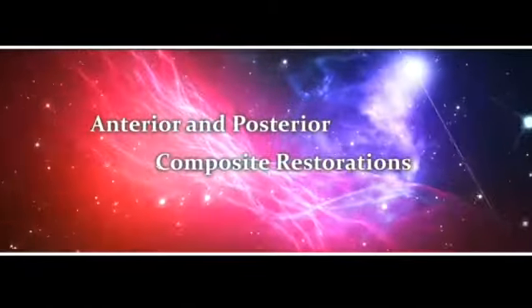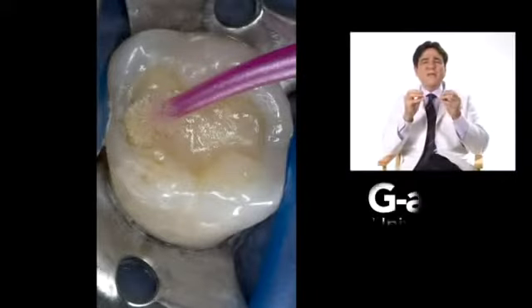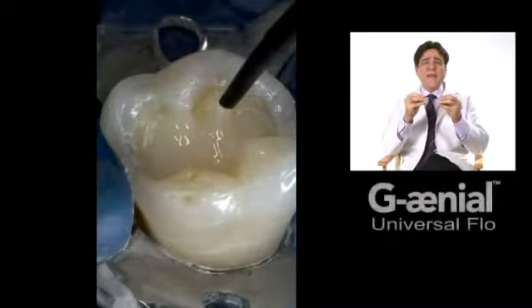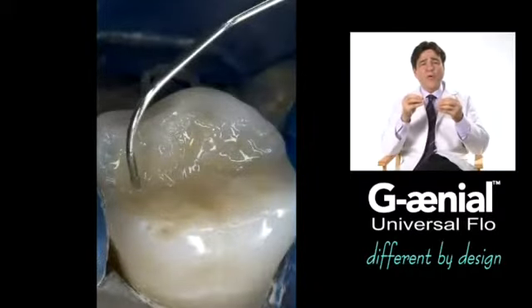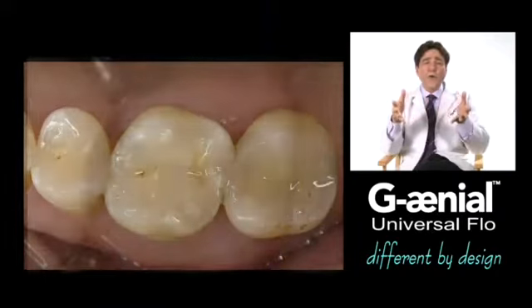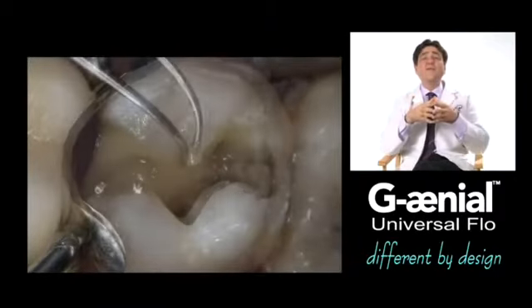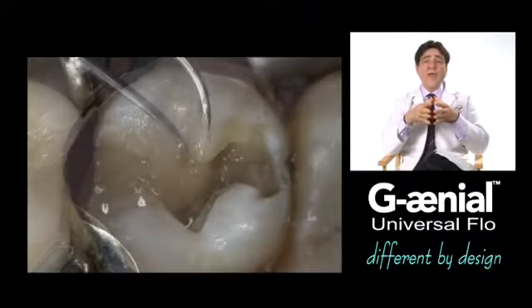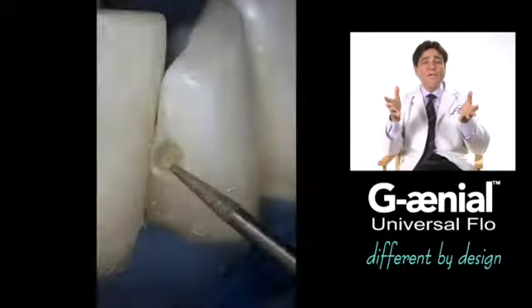For anterior and posterior composite restorations, by utilizing precise restorative placement techniques, conservative adhesive preparation designs, and a more thorough adhesive protocol, these advanced formulations such as G-aenial Universal Flo can be utilized for Class 1, Class 2, Class 3, Class 4, and Class 5 restorations, diastemic closures, and direct veneers.